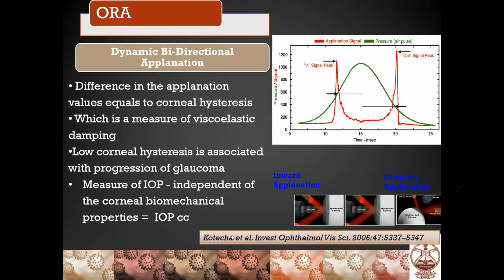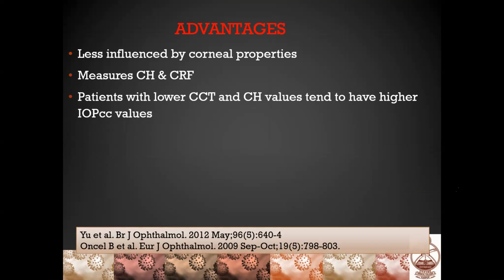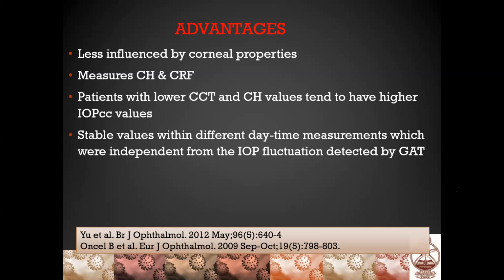So what are the advantages? It measures the corneal biomechanical properties and gives you cornea compensated intraocular pressure. Moreover, the values are stable at different points of the day, and it is a non-contact device. So these are all the advantages. As for disadvantages, it provides slightly higher values, and moreover it is expensive.